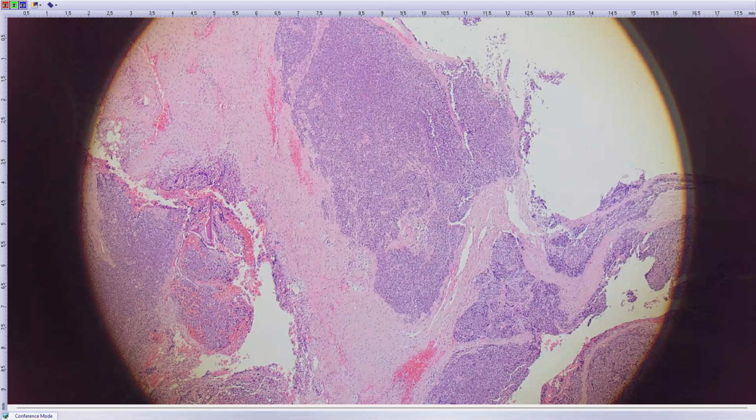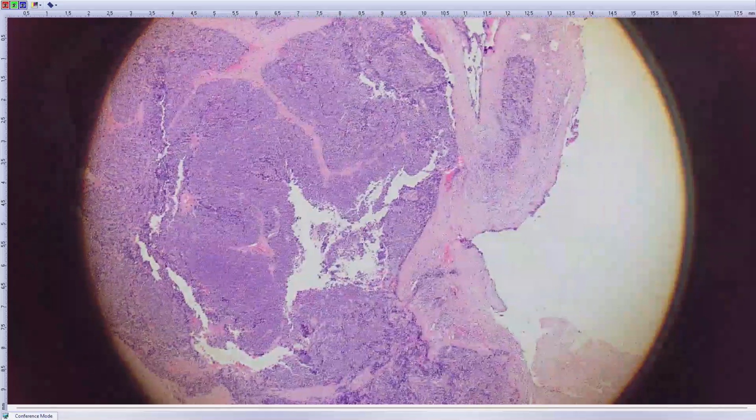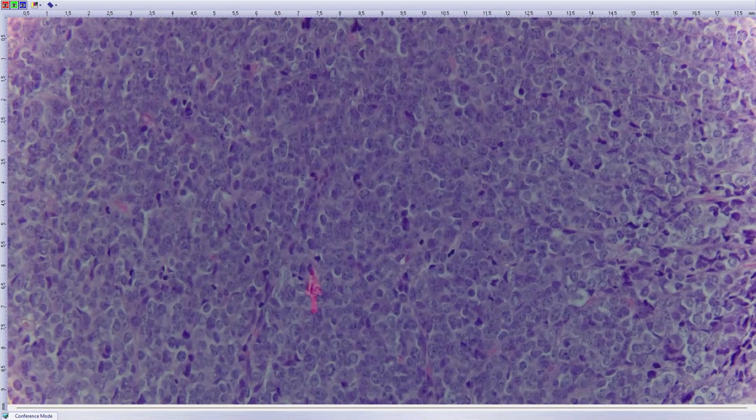So another case here, it was a young adult, tumor somewhere in soft tissues, highly cellular blue tumor. And when I go on higher power, perhaps the most striking feature of this tumor, besides that it's cellular and blue, is that the cells are very much like each other and they don't overlap too much. So it's a round cell tumor. Of course, you have to exclude melanomas, carcinomas.